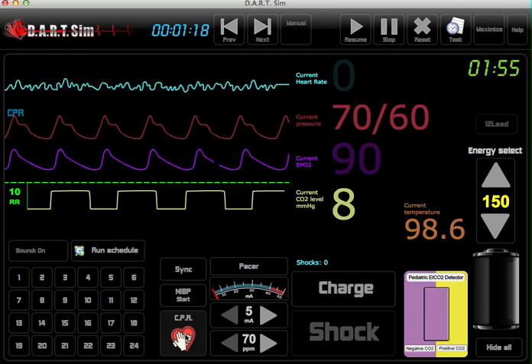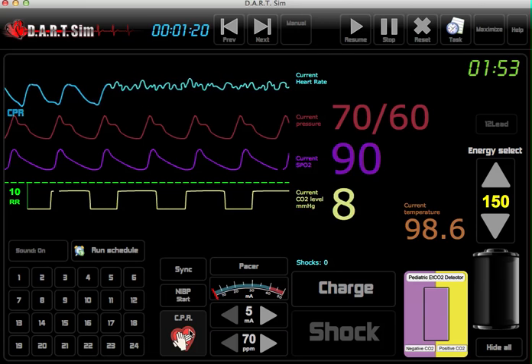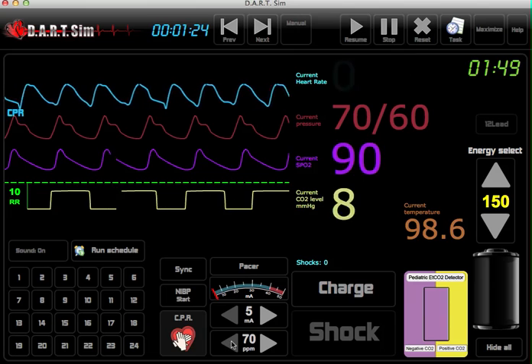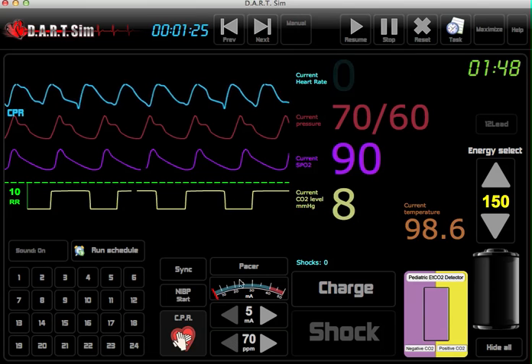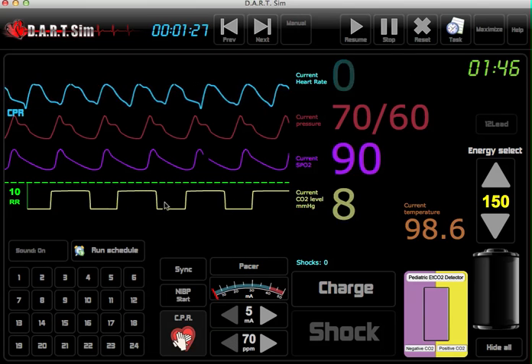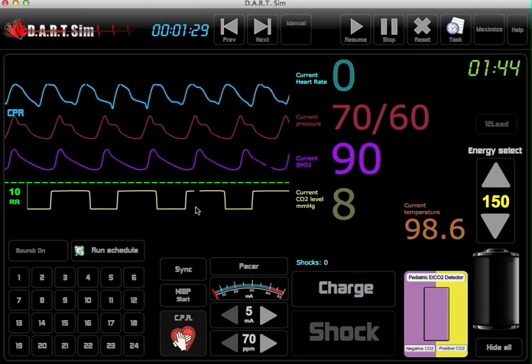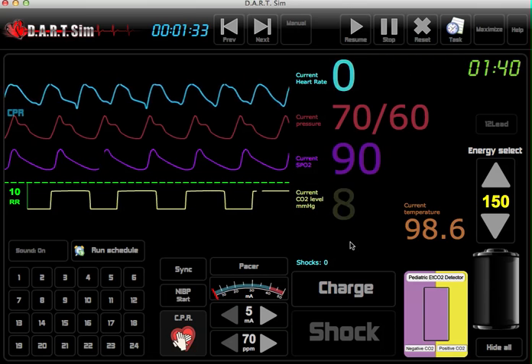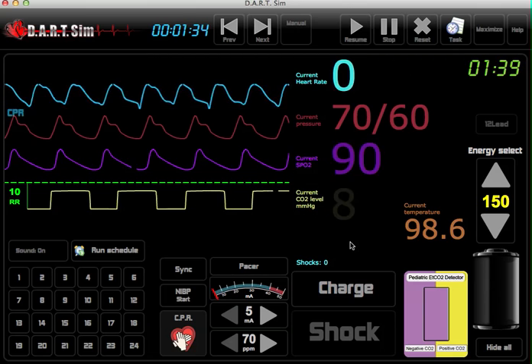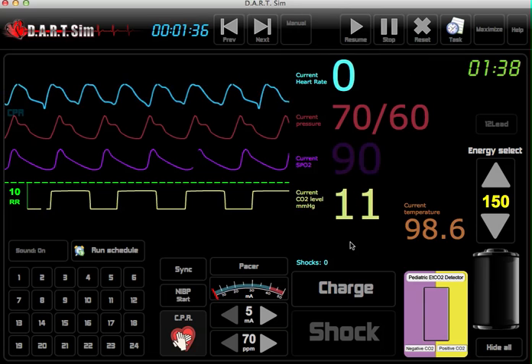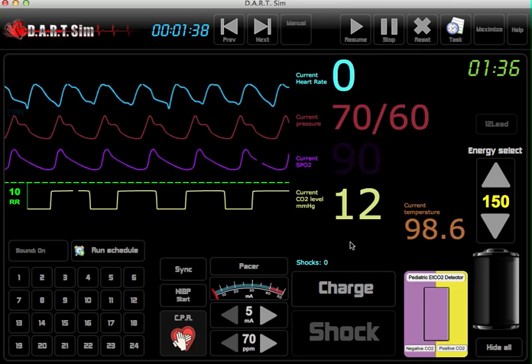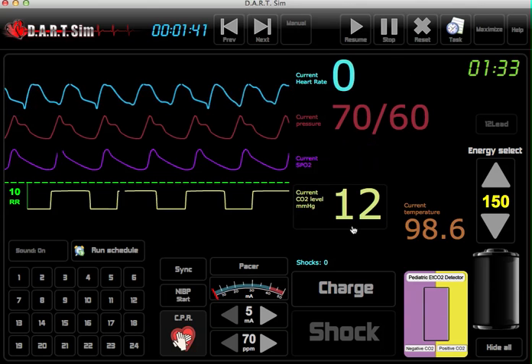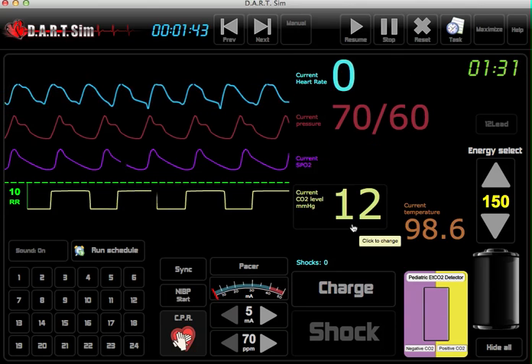We've got our CPR button and our metronome at 100 compressions per minute. We have our waveform active capnography here, so you can also change the CO2 by holding the C key and then hitting the plus or minus to adjust that manually — based on how well students are performing compressions.